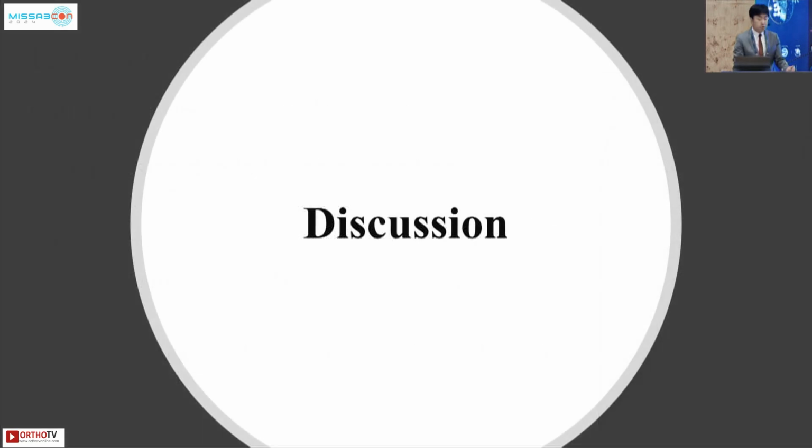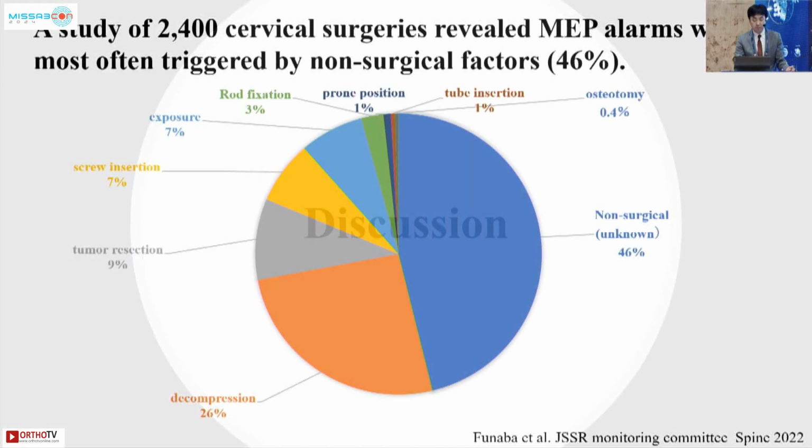In the discussion, a higher proportion of MEP alarms were associated with non-surgical factors, highlighting the need for vigilance in monitoring and addressing non-surgical risks.